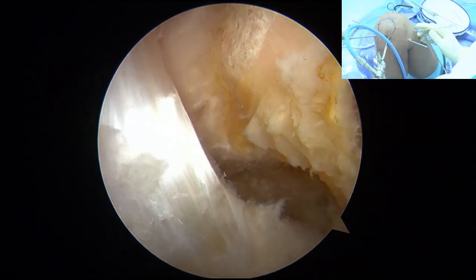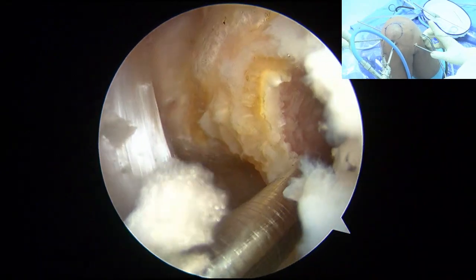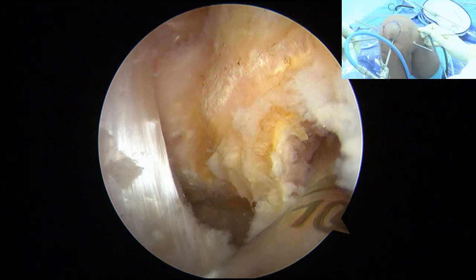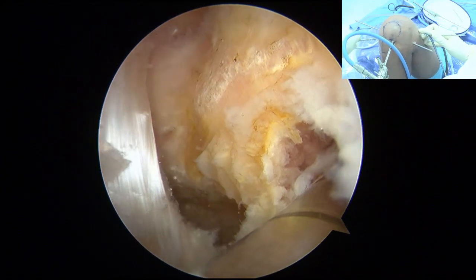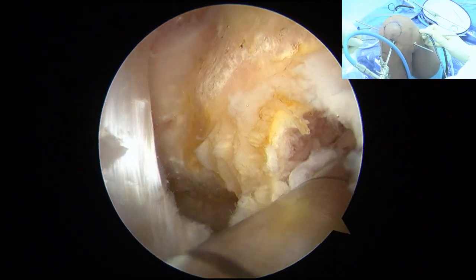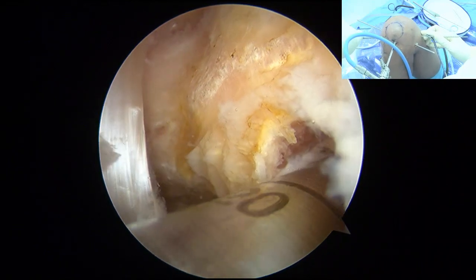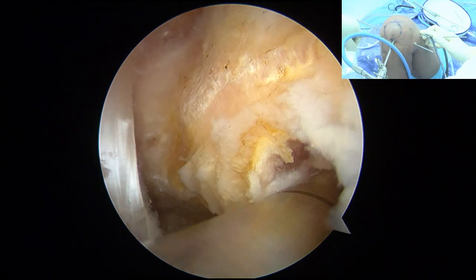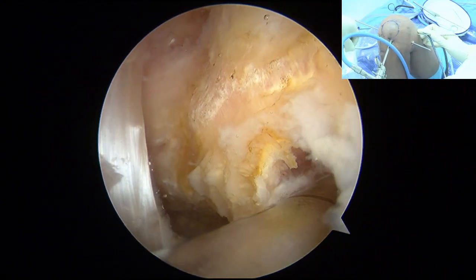So from the study of the ideal point, we found that if you intersect with the I, D, E, A, L, so the ideal point is here, below the resident's ridge or lateral intercondylar ridge, okay?